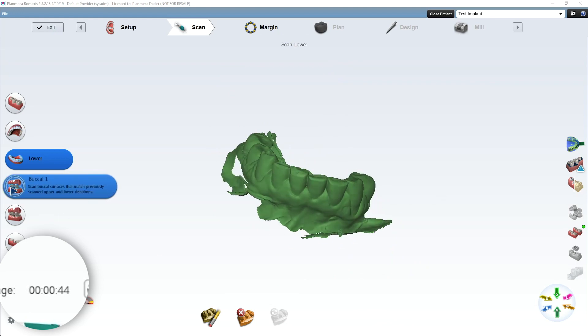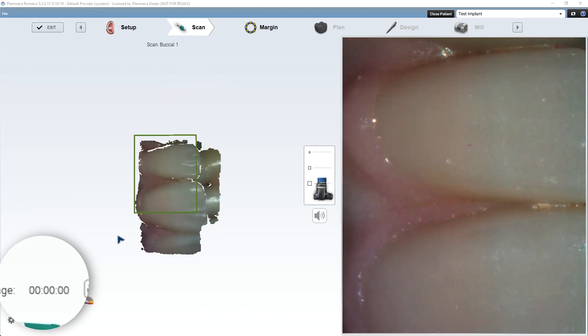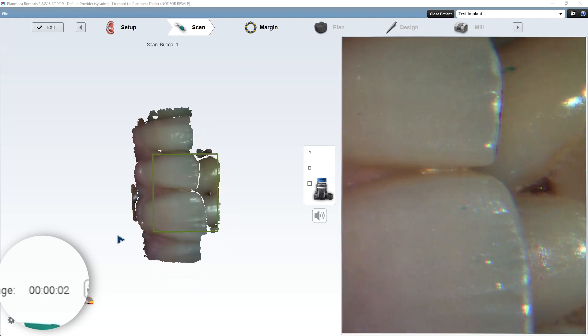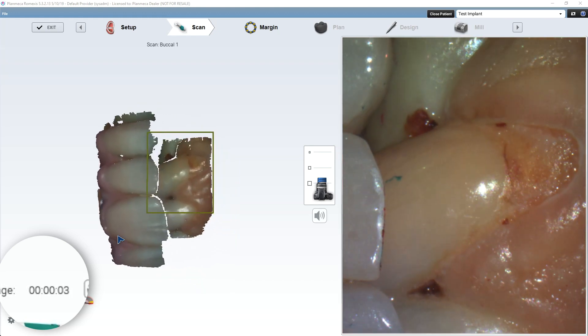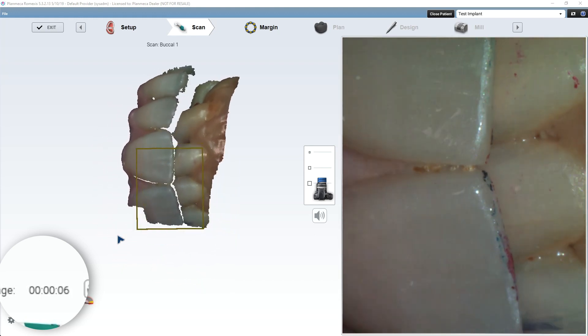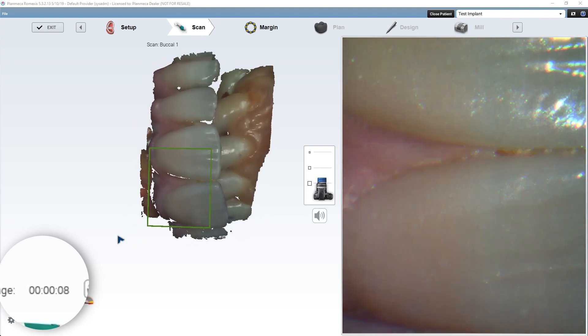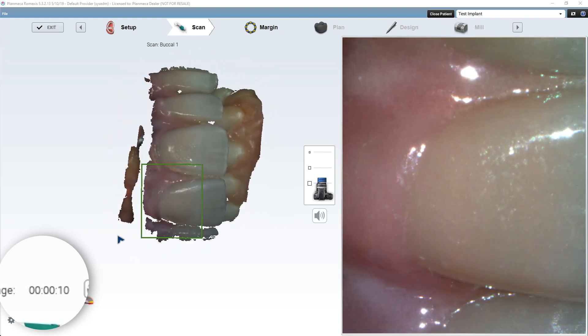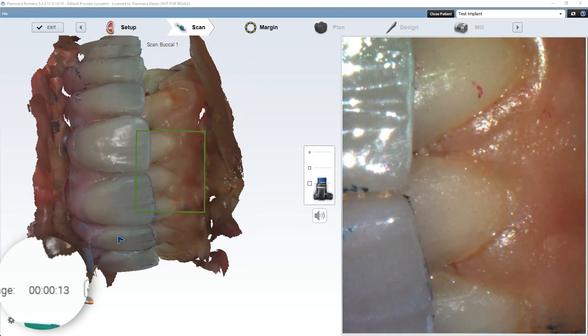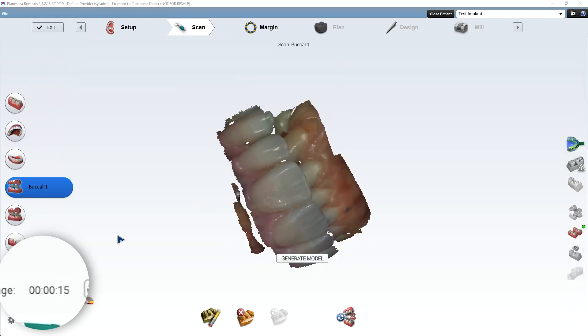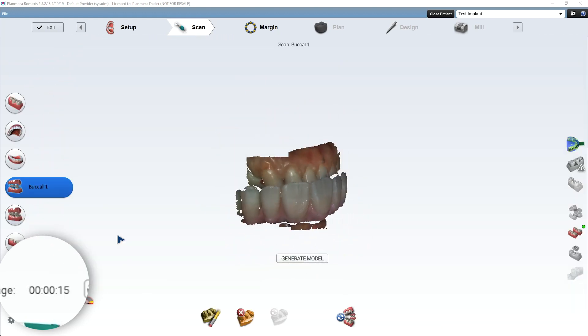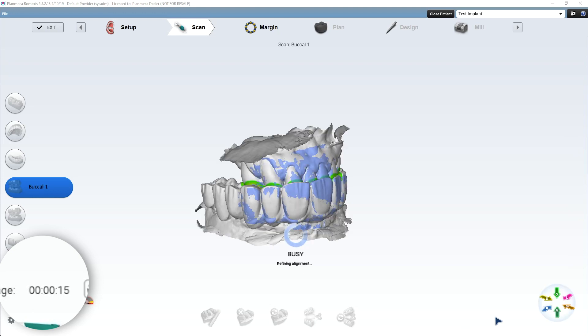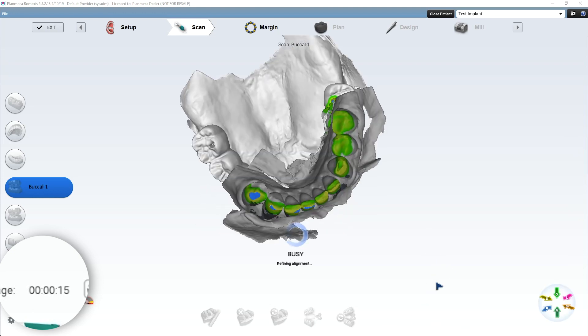Okay, so we're on the bite tab now. It's kind of hidden from the magnification of the scanner. And bite scans for me are slow scans because you want to give the computer some time to merge the models together like that. So now this is going to render. So now we have basically the upper prosthetic, the lower, the bite merged.